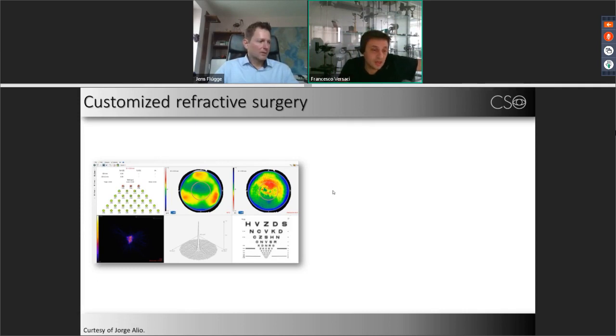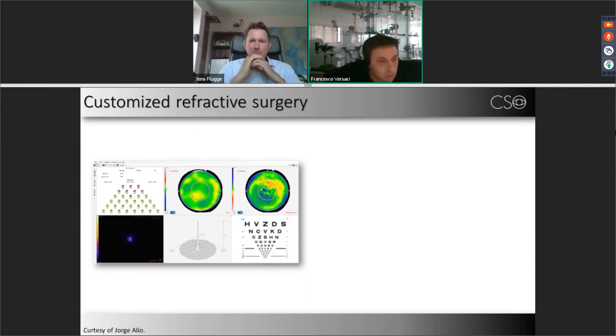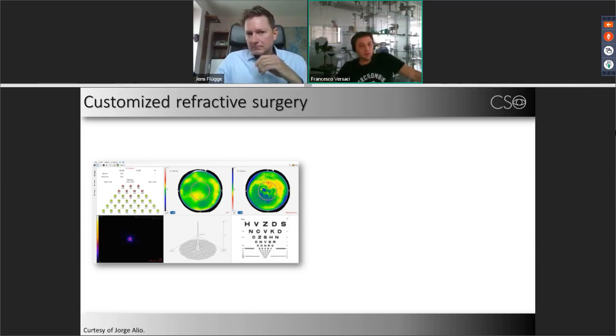So the surgeon decided to remove some of the high order aberration polynomials. He ended up choosing to remove the spherical aberration and all the third order, and evaluated that the quality of the vision was good enough and also the wavefront was planar enough.